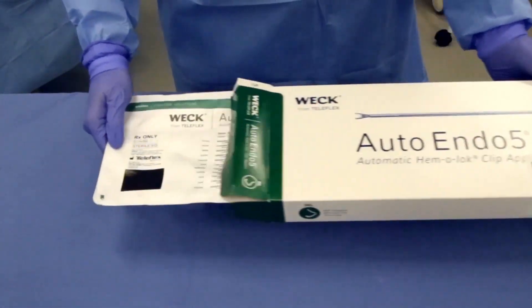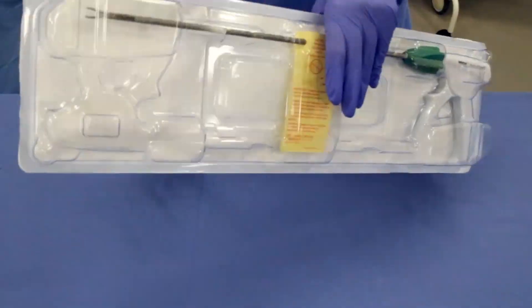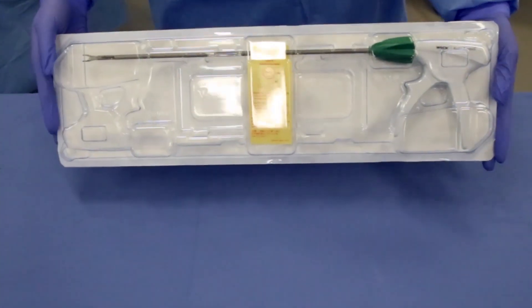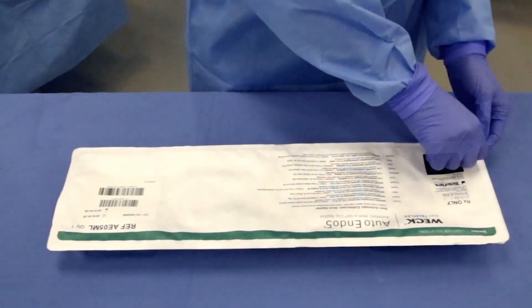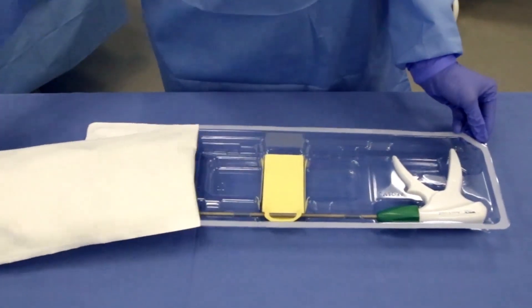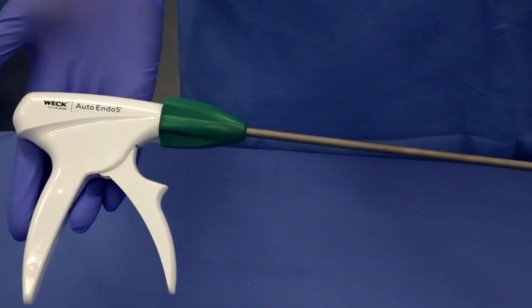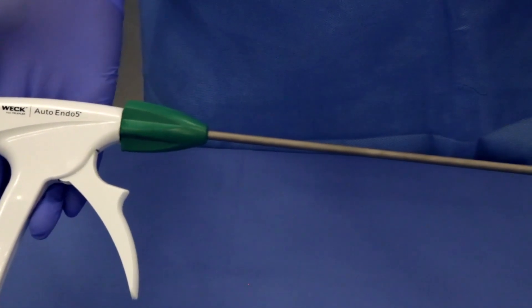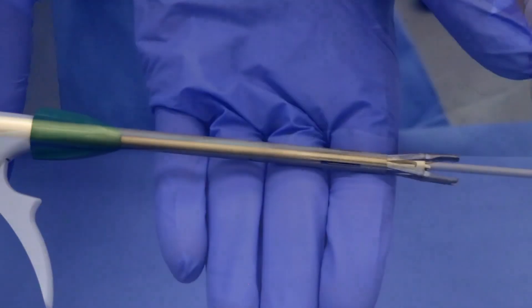The Weck Auto Endo 5 Automatic Clip Applier provides enhanced ligation, confidence, and security in an automated delivery platform that is designed for procedural convenience and flexibility. It comes packaged in a Tyvek sealed tray and is indicated for single use. The 35 cm shaft contains 15 medium-large Hemolock clips. The applier's extended length compared to the previous version of this device enhances reach and procedural flexibility.